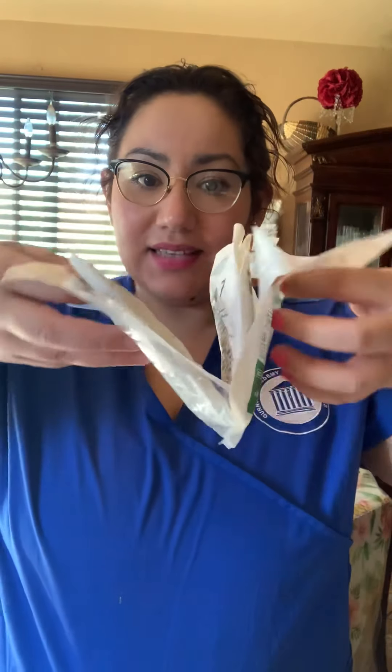I'm going to go ahead and grab my gloves right here. When I'm grabbing these, I'm going to make sure that the gloves don't have any water stains, that they're not open or torn, and also that they're not expired. I'm going to make sure that they're also my size, which they are.